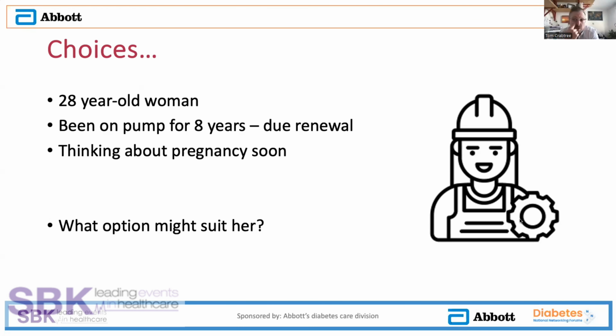But CAM APS is the only one with a target low enough to reach those really tight targets of pregnancy. So we really should be offering this as the preferred choice for women both planning pregnancy and during pregnancy, where that happens unexpectedly and unpredictably, as it often does for some of our patients.